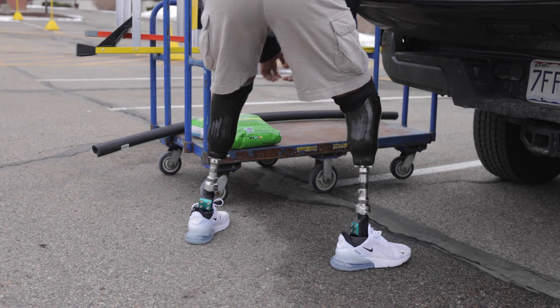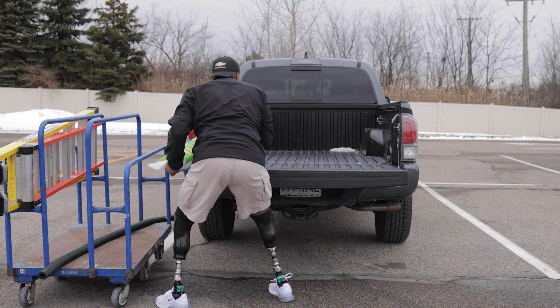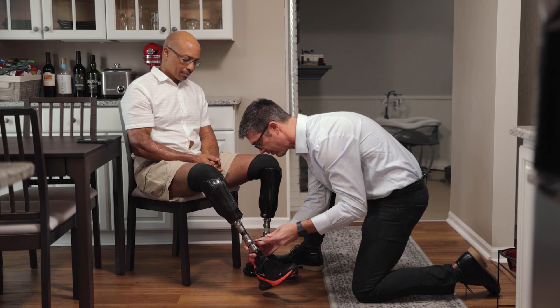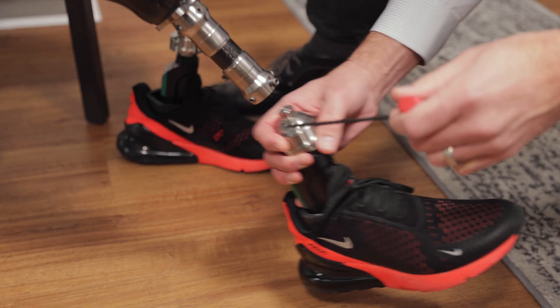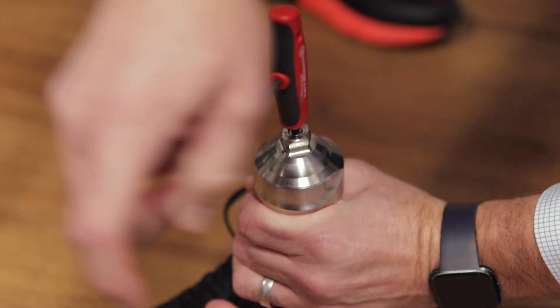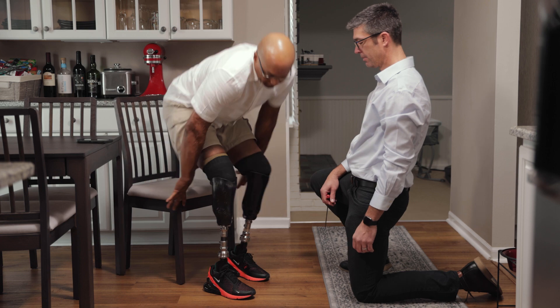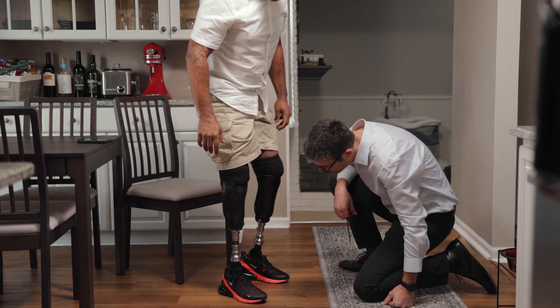Whether you're playing tennis with friends or simply loading groceries into the car, the Voyager may improve comfort as you twist and turn. With simple adjustments using a four millimeter hex key, the unique torsion mechanism uses a ball bearing design to help provide additional energy return during transverse rotation.